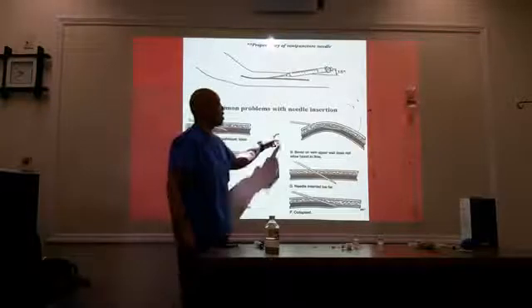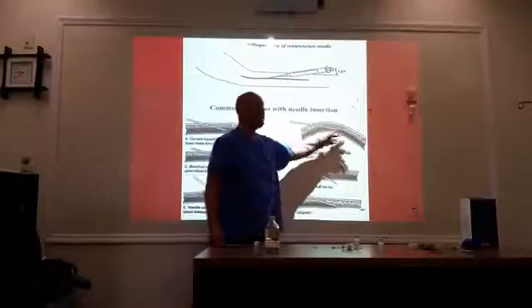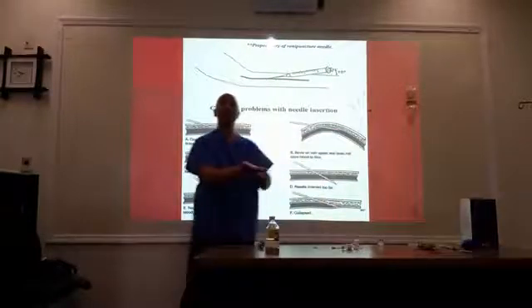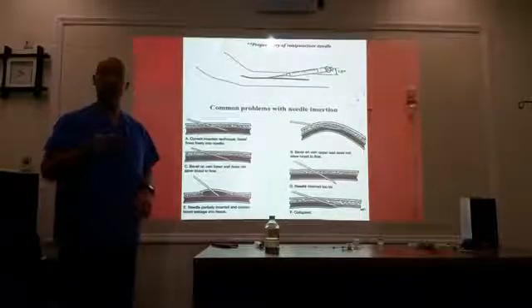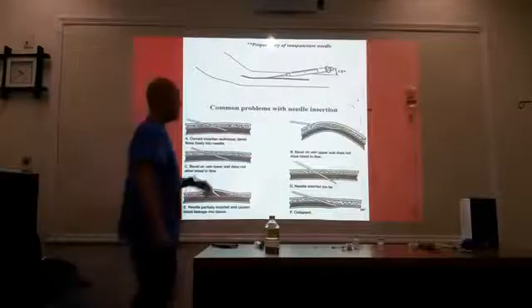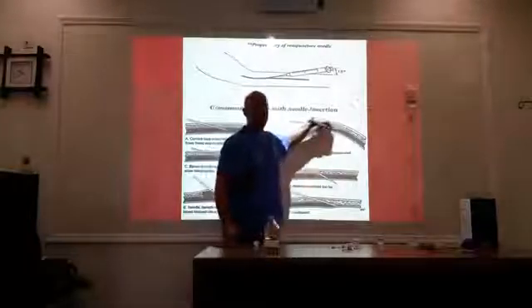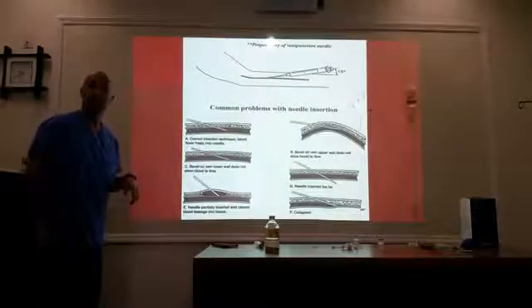If you are going around a curved vein, you may be in, but the bevel is pressed up against the vessel wall. Are you going to get blood return? Probably not, so pull it back just a little bit. You don't want to go any further, because if you go any further, what's going to happen? You're going to puncture through the vein. This is how you also get a hematoma.